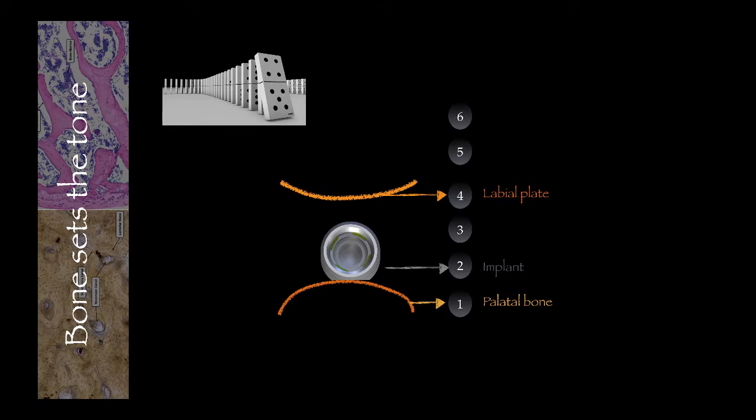And then you need to choose the correct size of your implant. In the past, we used to think go for wide implants to give us mechanical stability. And this is right. The wider the implant, the more mechanical stability you're going to get on the long term. However, we do understand now that if we go for a wider implant, we're going to invade the space which should be filled with bone for protection. So nowadays, our recommendation is to go for the narrowest implant mechanics allow you, or go for the widest implant biology allows you. So it has to be a multifactorial decision. We never go for very wide implant in the anterior region, full stop, period.